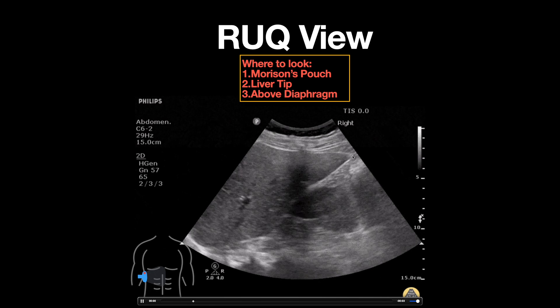As seen in this clip, make sure you are fanning through the entire space from anterior to posterior.